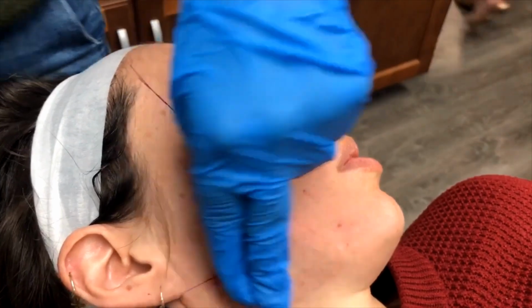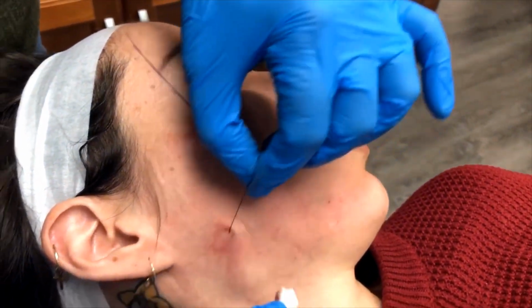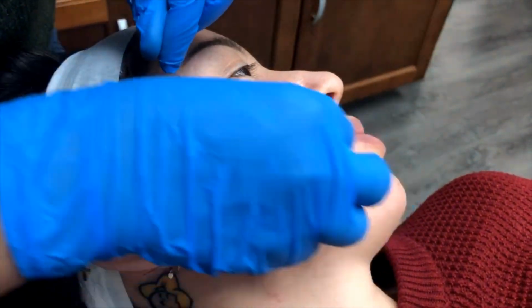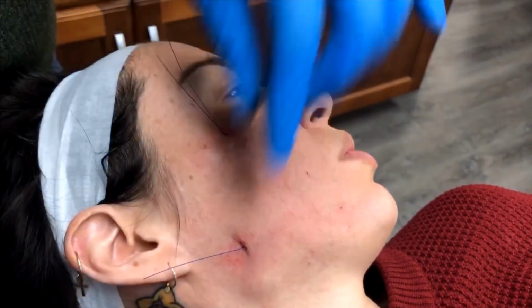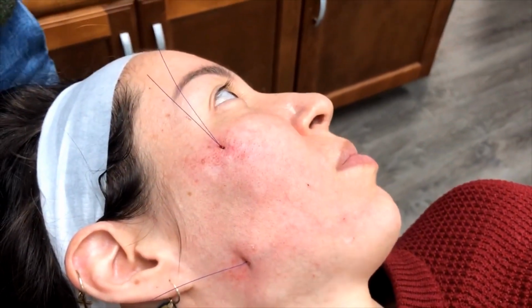3 threads. I can't make that point enough, because you can watch other trainers use other threads, and there are so many more threads. Well, why do you need more threads? Because they're using fairly weak threads. And again, make sure they're legal threads to boot.